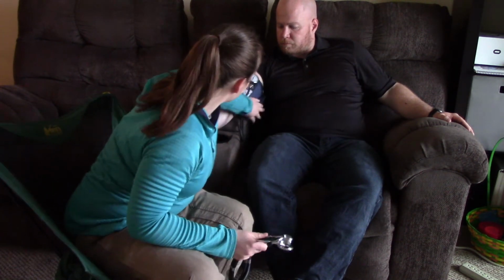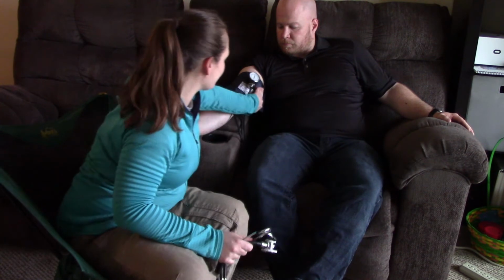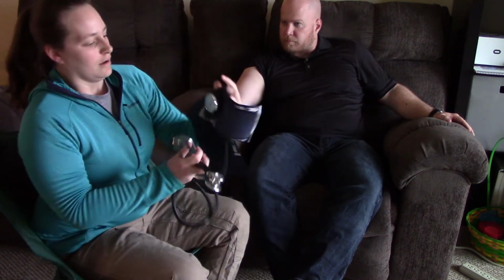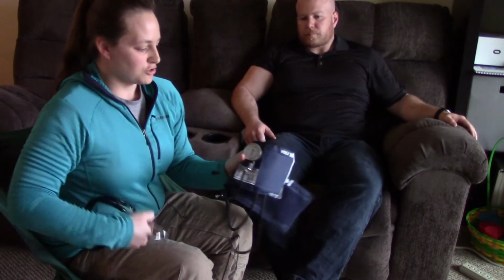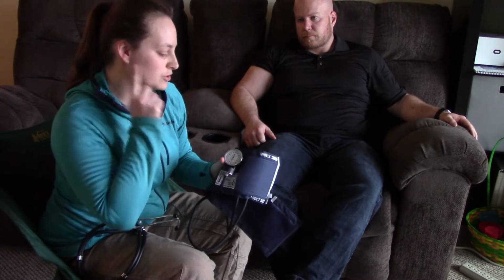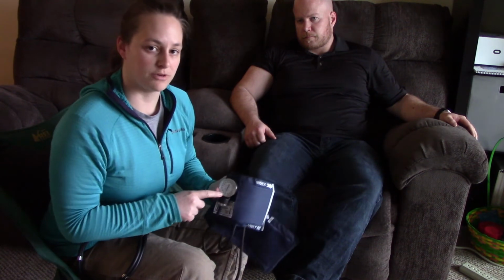That may be a little high for an adult, but probably not unusual given that we're on camera and I'm using a cuff that's not the perfect size for his arm. One thing to take note of is that as you watch the needle drop, you want to make sure that you're listening for the heartbeat and not looking for the needle to bounce. Sometimes the needle bounces, but that's not the measurement you want to take.